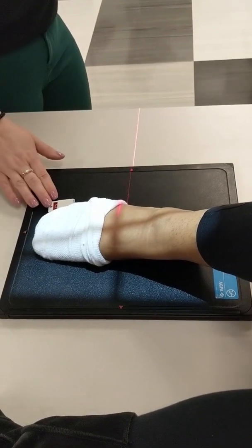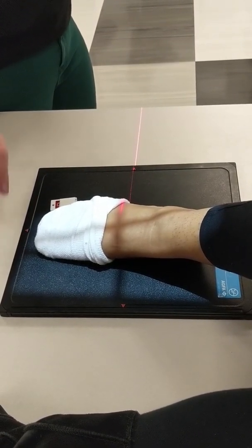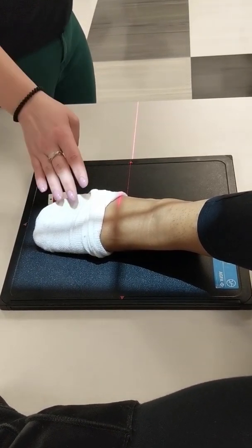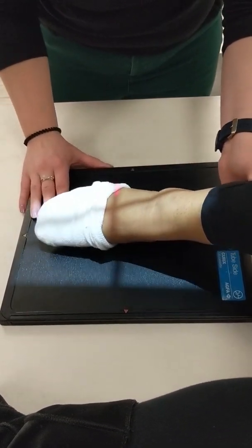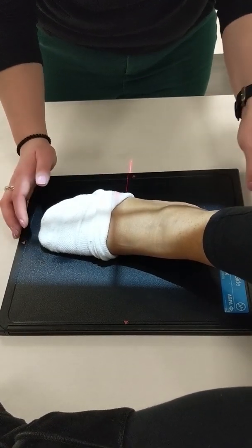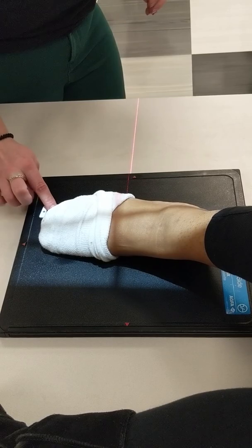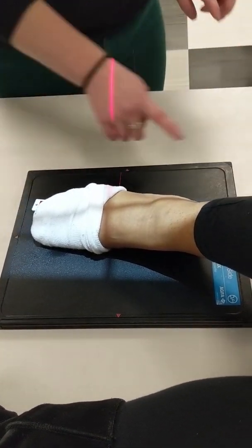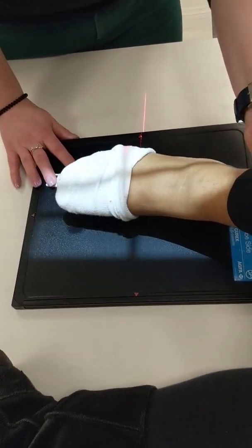So now we're no longer aligned on our IR. So with CR, part, and IR alignment, our CR and our part are aligned. So I'm going to lift up her foot just a little bit and center back on my IR. Okay, good. Marker is on the lateral side still. We've included her toes and her calcaneus. On her, we were able to collimate just a little bit. Lift up just a little bit. Not center this way. There we go.